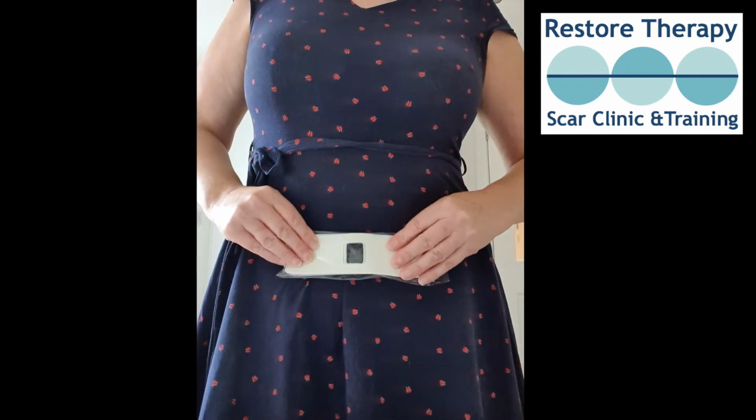And having recently come out of a rock tape course and looked at the fact that the use of elastic tape draws the body's attention, and also you can use it to take off pressure. So if you put this on correctly, what you can do is stick the bottom half, slightly lift the tension up, and then stick the top half. And what you're doing is you're actually taking tension off the scar, which again, there's been some research to show that tension in an area can increase scar tissue.